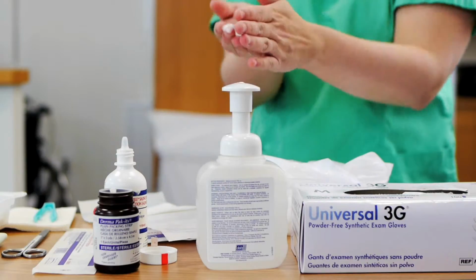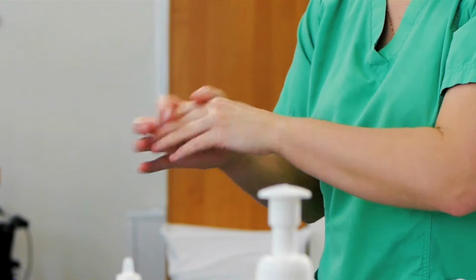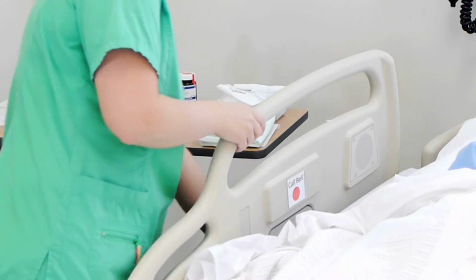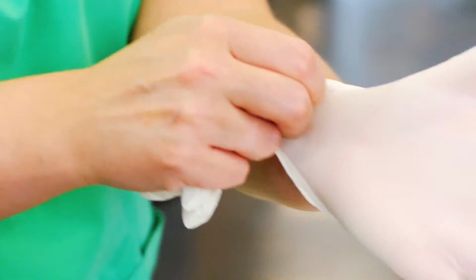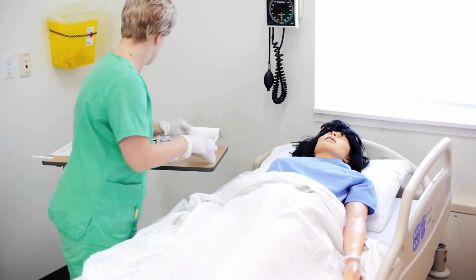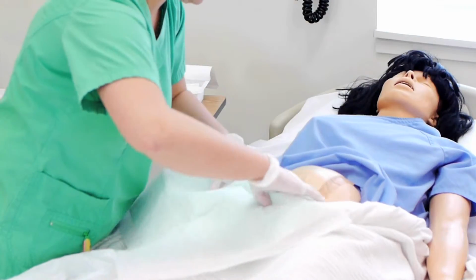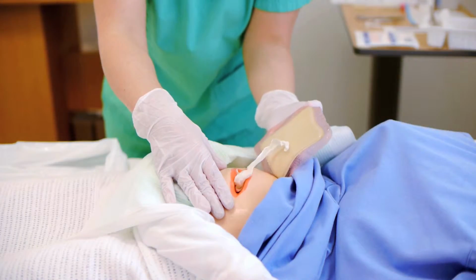Perform hand hygiene. If splashback is anticipated, apply appropriate personal protective equipment, like goggles and a gown. So we're going to take a swab today and send it away to see if it's growing anything. I'm just going to remove your dressing and clean your wound.